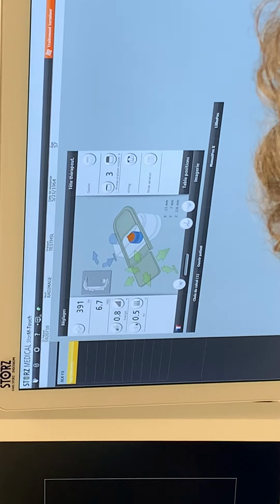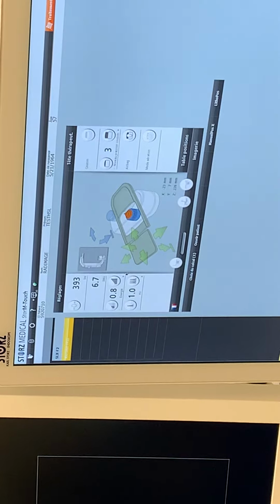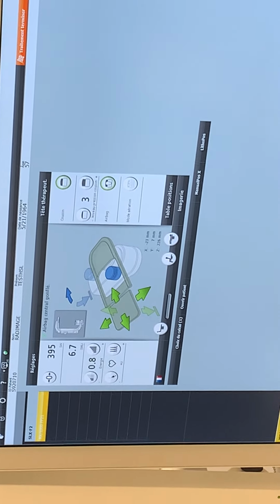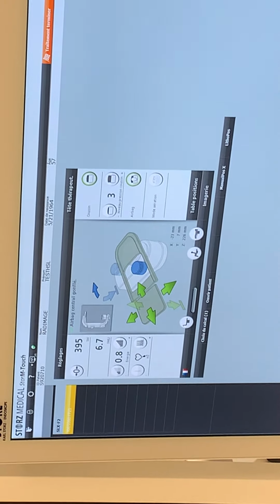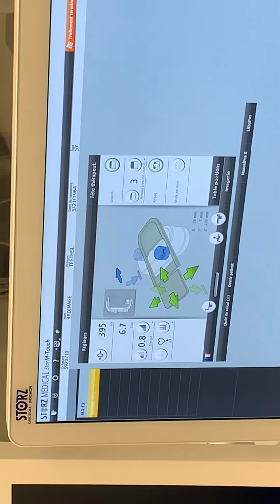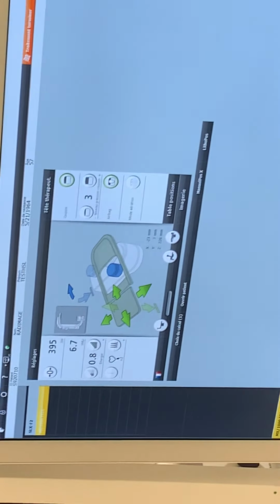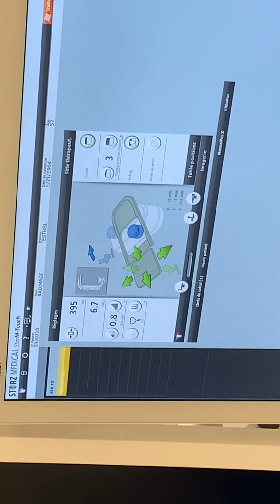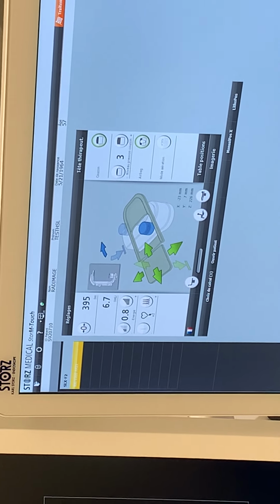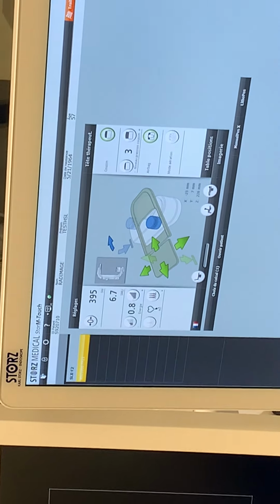I have a question. Do we have the opportunity to do it with the heart rate? Yes, we have. Therefore, we need to stop and lower the frequency until you have a heart symbol there. You need to connect the ECG to the body. It's always connected, at least here. Then you can go to the ECG mode and trigger to the heartbeat. It makes sense for patients with a pacemaker or something like that.